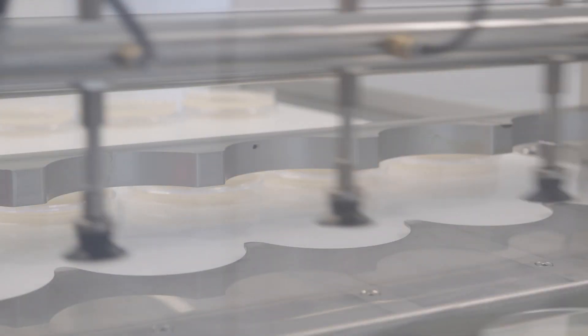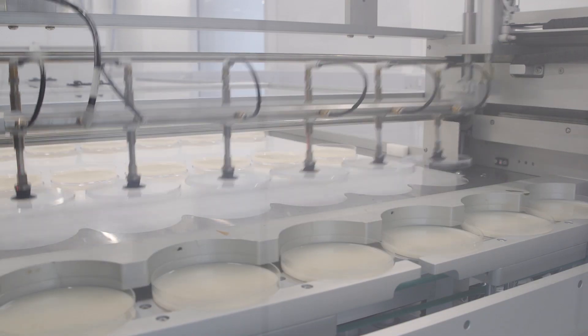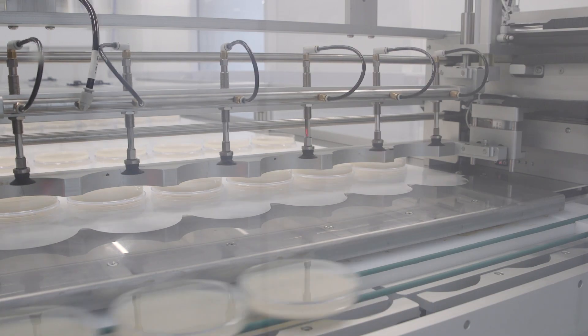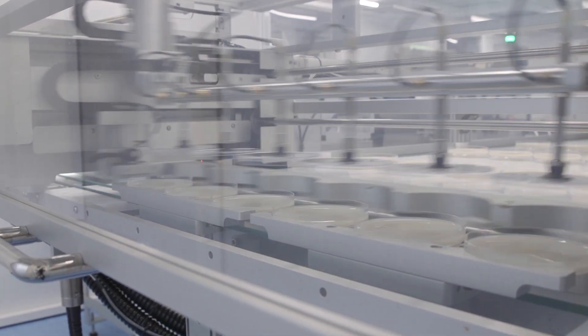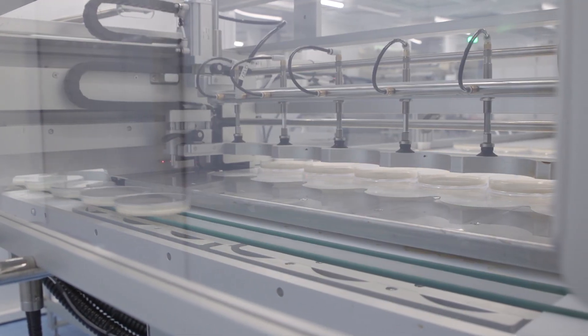Plates are filled and moved along the line to be dried and labelled. The plates are labelled with a product code, lot number, time of manufacture and expiry date. This provides traceability to the previously QC tested dehydrated culture media used through our system.